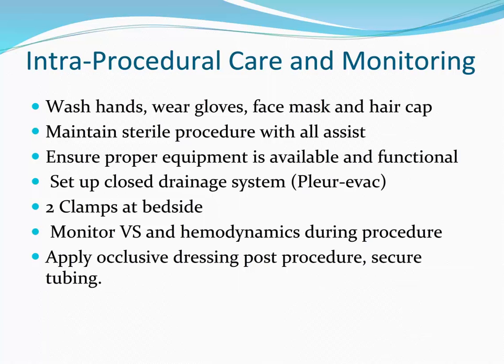Okay, now that you have gone through and completed your pre-procedure care, it is time to focus on the procedure itself. The first consideration is sterility. All clinicians in the room should have clean hands, hair cap, face mask, and gloves. The proceduralist will have a sterile gown and gloves while maintaining a sterile field and technique throughout the procedure. Make sure the procedure cart is close at hand and your PleurVac is set up and functional before the procedure begins.